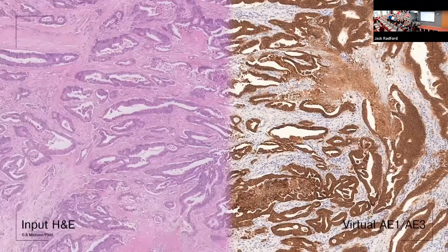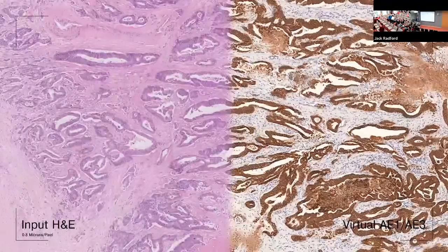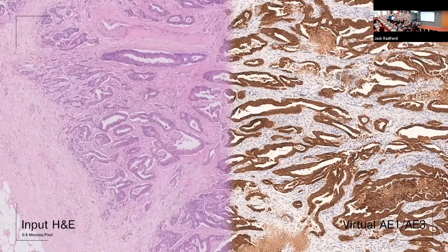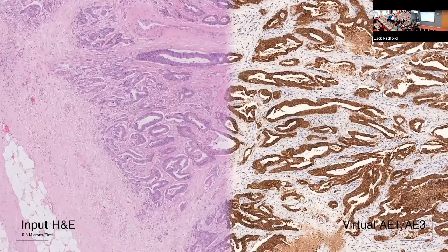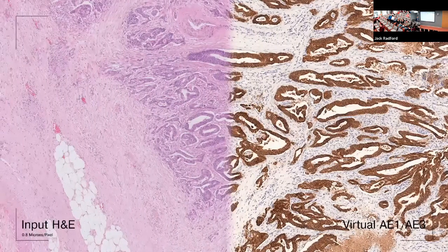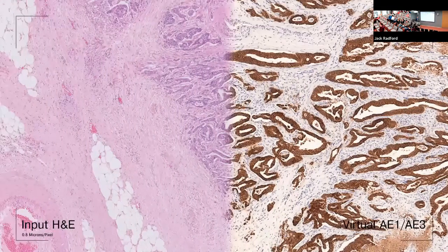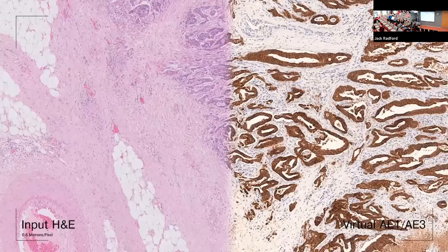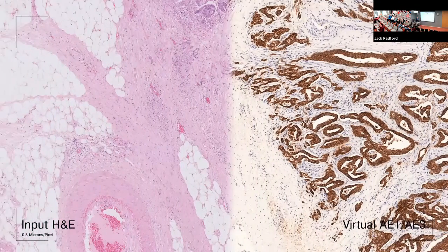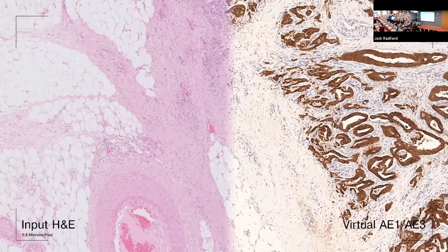You can see now it exactly preserves the structure, but also, most importantly, it applies the correct stain both to the tumour core and these little individual tumour cells, which are most important for diagnosis in certain cancer types like colorectal cancer and other solid cancers as well. So in this way, we can now provide almost real-time virtual immunohistochemistry based on these amended CycleGANs, which is really useful.